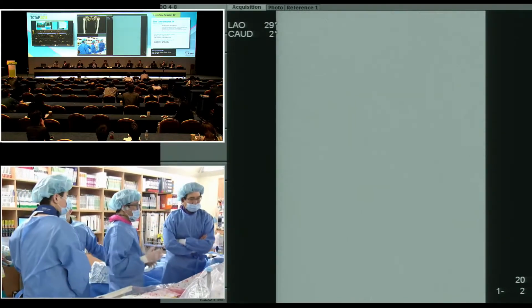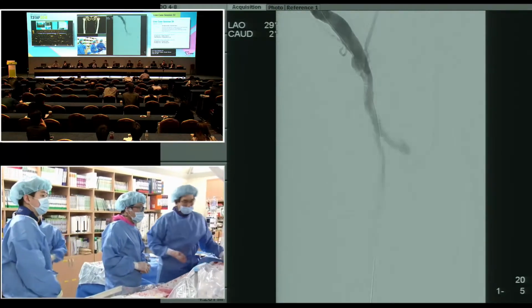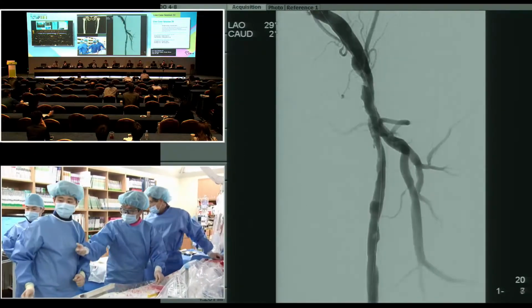So how about cutting a little bit more? Okay. Is it okay? Okay. Let's go about 3 or 4 times. Okay, let's go another round. Hawk One, please. Hawk One.